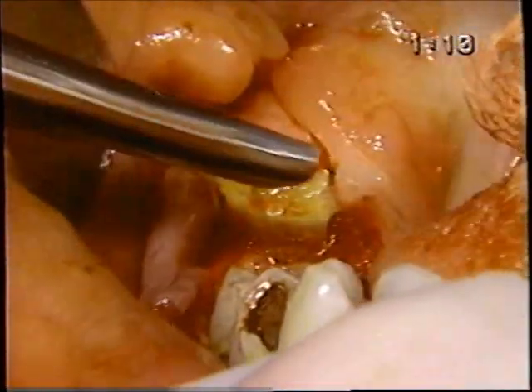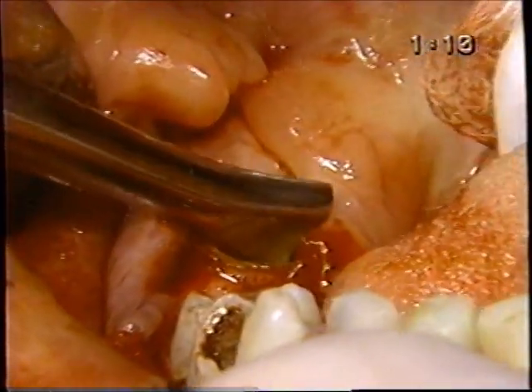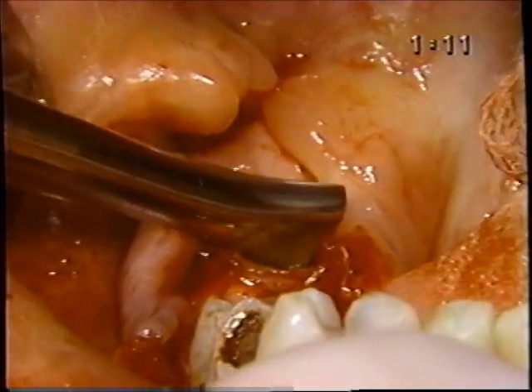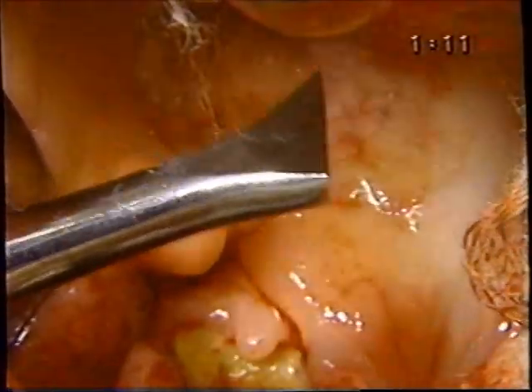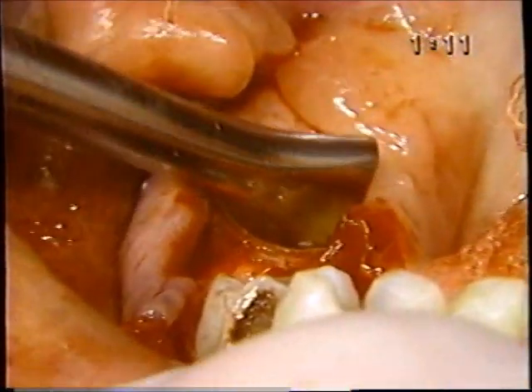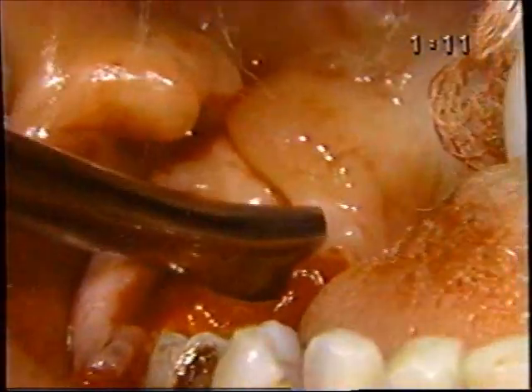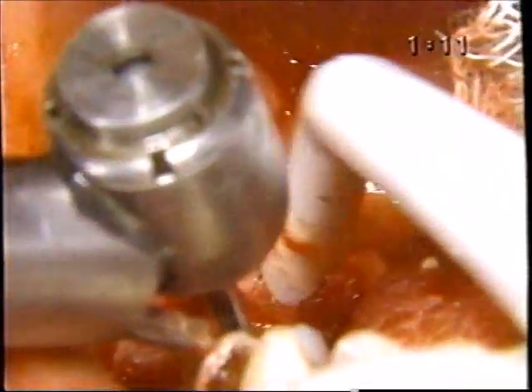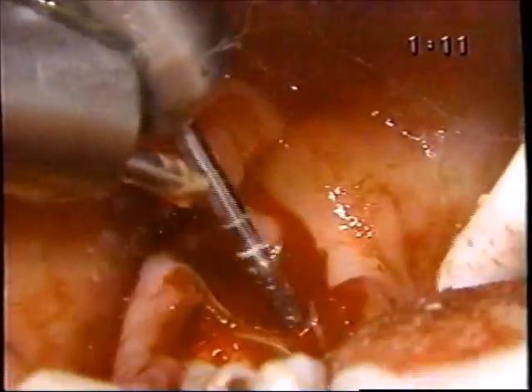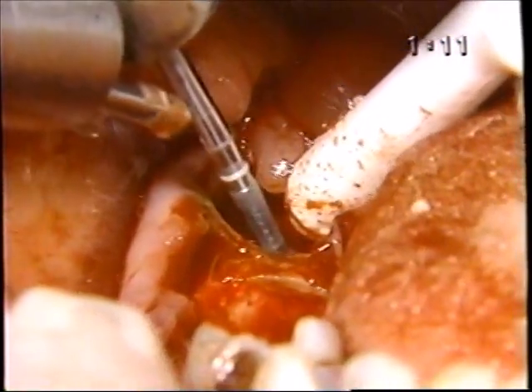As you can see, we've made a buccal to lingual section cut right in the middle of that, lengthwise in the middle of that third molar. We're going to use the mesial root as a fulcrum now with this medium-sized crier, we call it. There's different names for that instrument. We're trying to engage the root, and it looks like it broke off. That's okay. And then we will do interseptal bone removal so that we can get a purchase, this wide area of bone between the second and third molar.